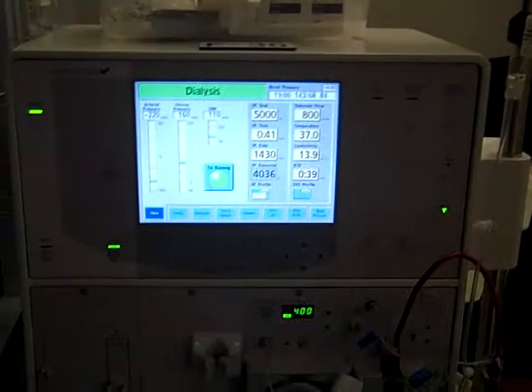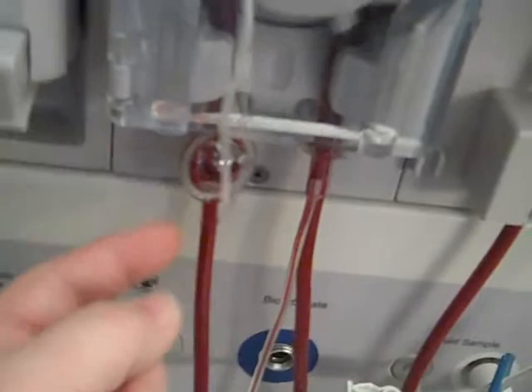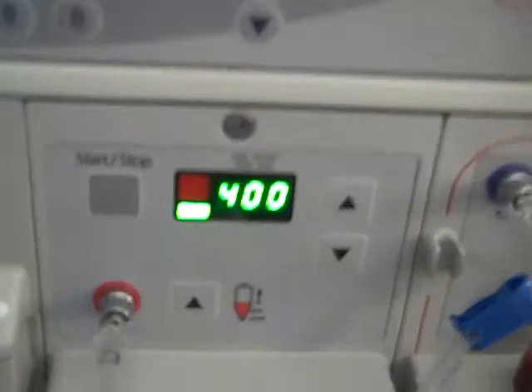This is a Fresenius 2008 K2 model dialysis machine. As you can see, there are two bloodlines that run from the patient. One is running from the patient arterial line and it comes up through here. This round device here is a pressure sensor and it monitors the pressure coming from the patient — we don't want it to get above a certain rate, so we monitor it there. Then this is the blood pump that is actually drawing the blood out of the patient, and it's running at a rate right now that will process 400 milliliters a minute.